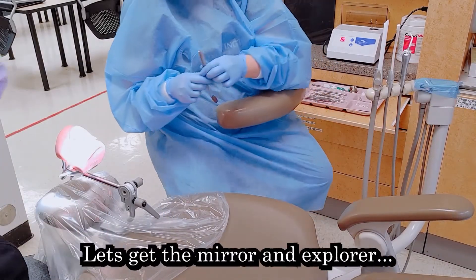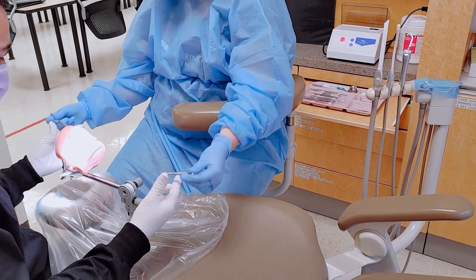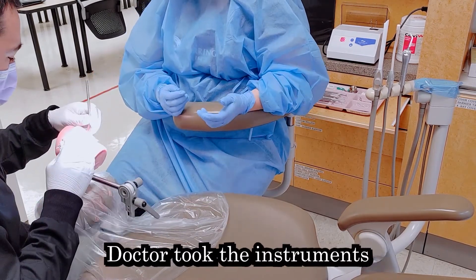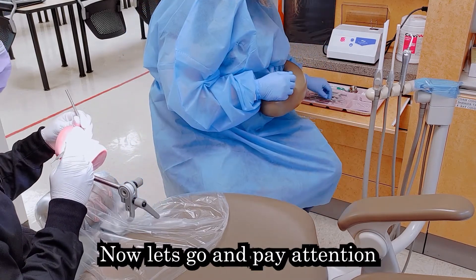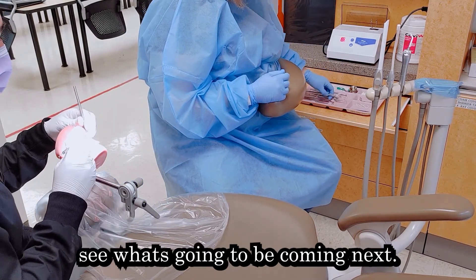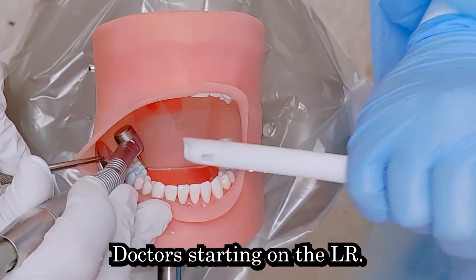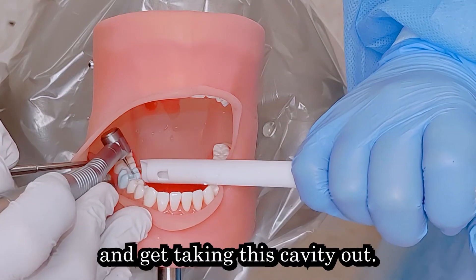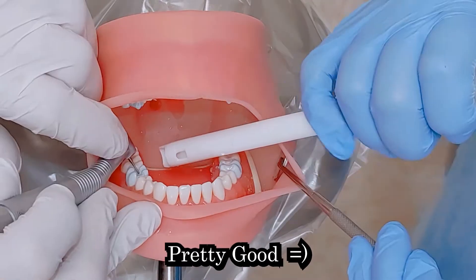All right, so doc's ready to look at the tooth. Let's get the mirror and explorer. And all right, that's a good start — doc took the instruments. Now let's pay attention to see what's going to be coming next. Doctor's starting on the lower right, so let's get my suction in there and start taking this cavity out. Pretty good.